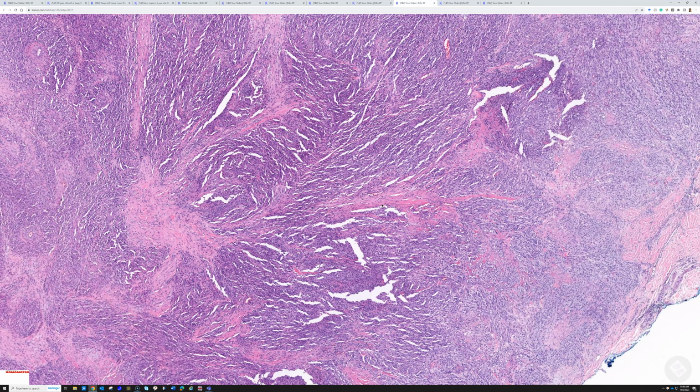And I think we are so used to thinking about Kaposi sarcoma and angiosarcoma, for that matter, having a lot of erythrocytes, having a lot of blood in them, because they're vascular tumors. But some cases do not. And it's important to recognize that when we don't see the blood, sometimes our brain just skips right over thinking about vascular tumors. So one lesson that my mentor Mark Edgar taught me was that if you have a neoplasm that you're having difficulty classifying and your usual panel is negative, don't forget to do a vascular marker.